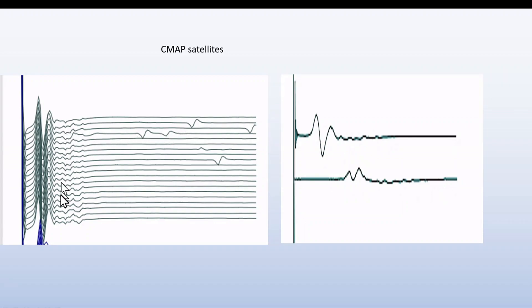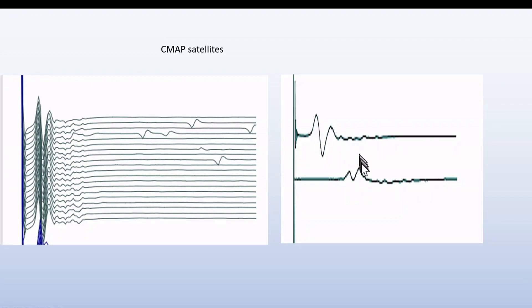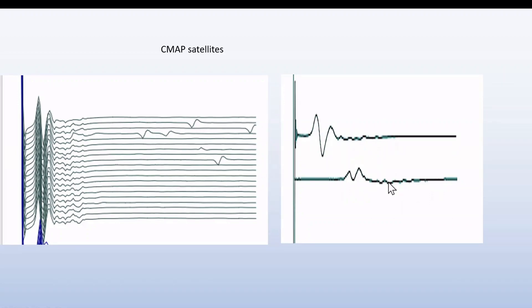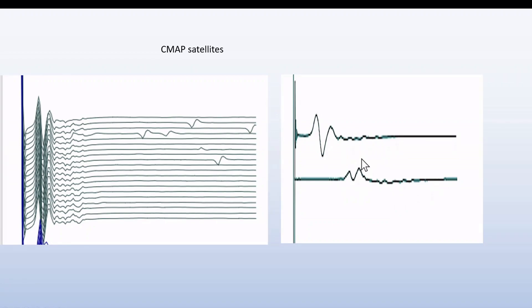Here we have an example with many late components, and we have the same shape of late components in both distal and proximal positions. So these are very likely CMAP satellites, without needing further testing.